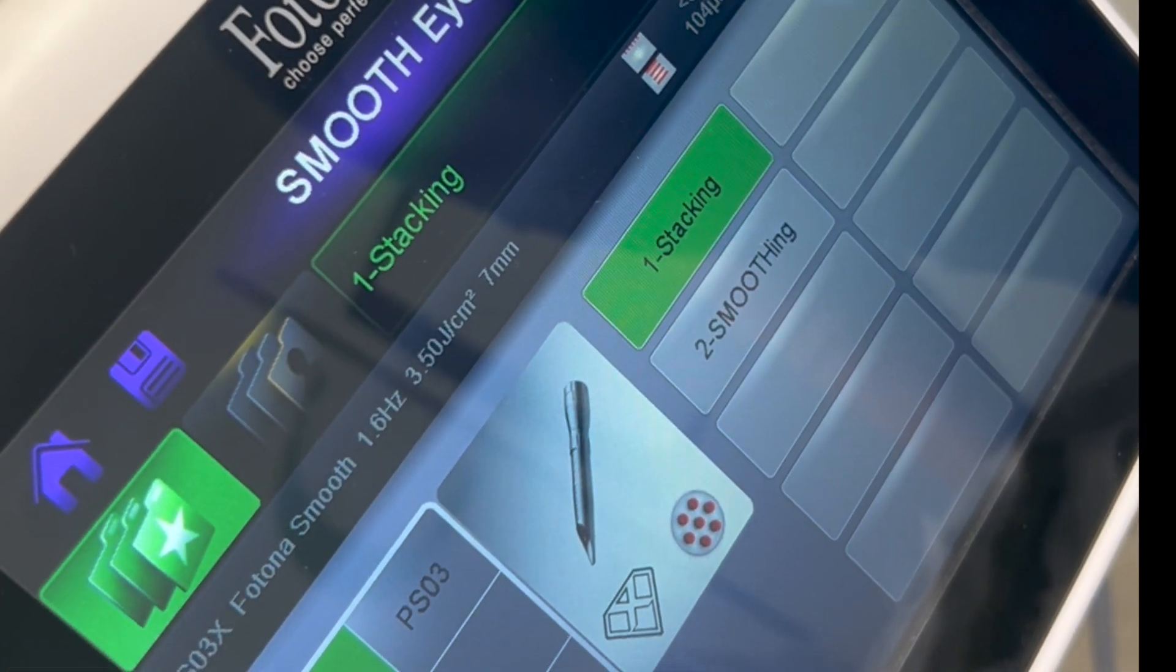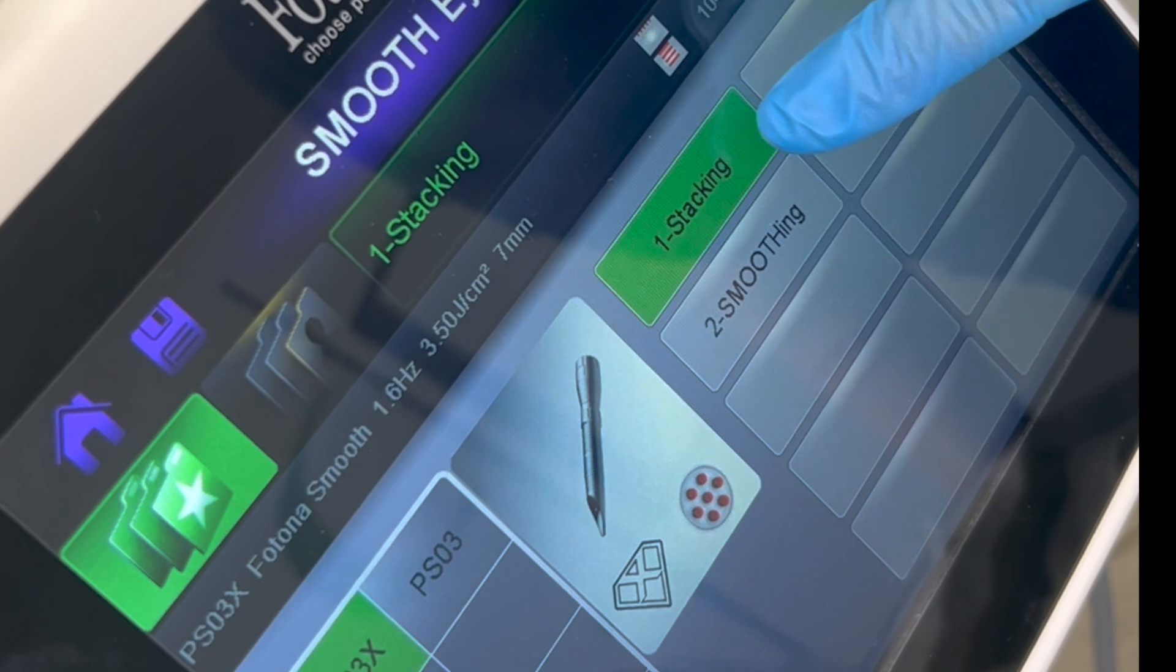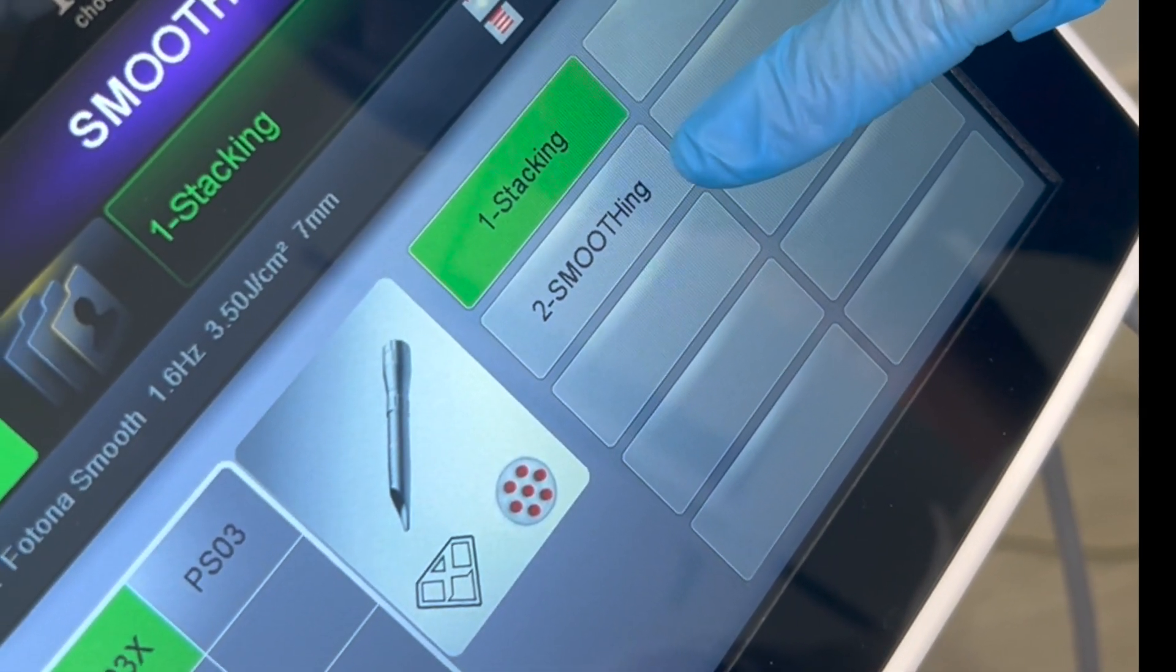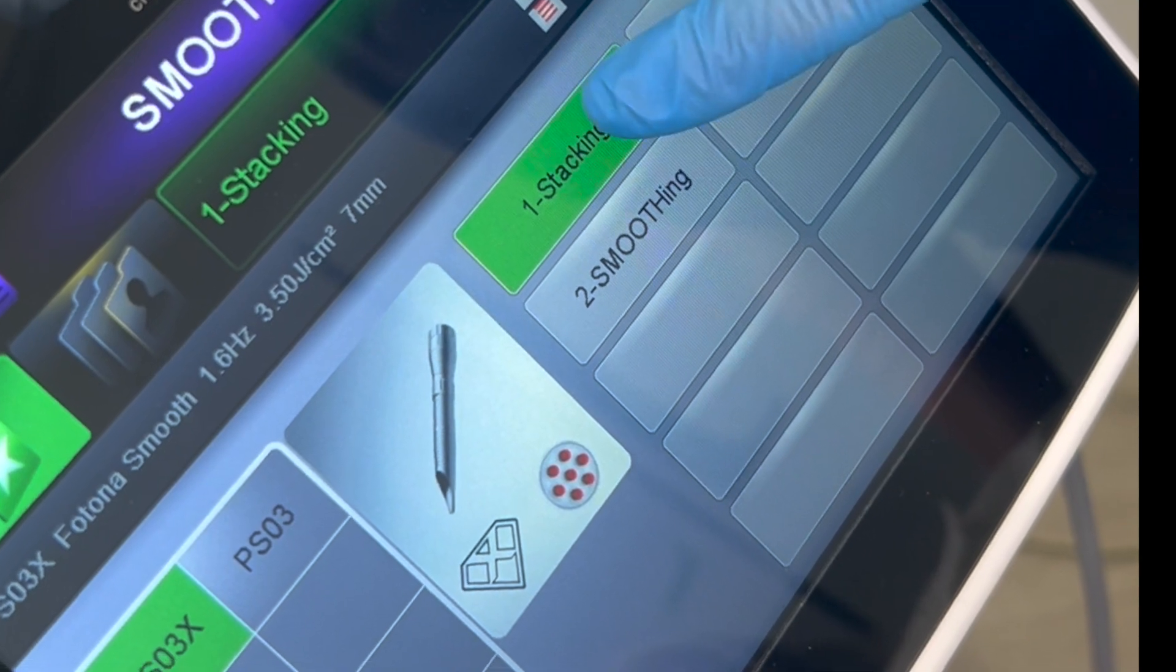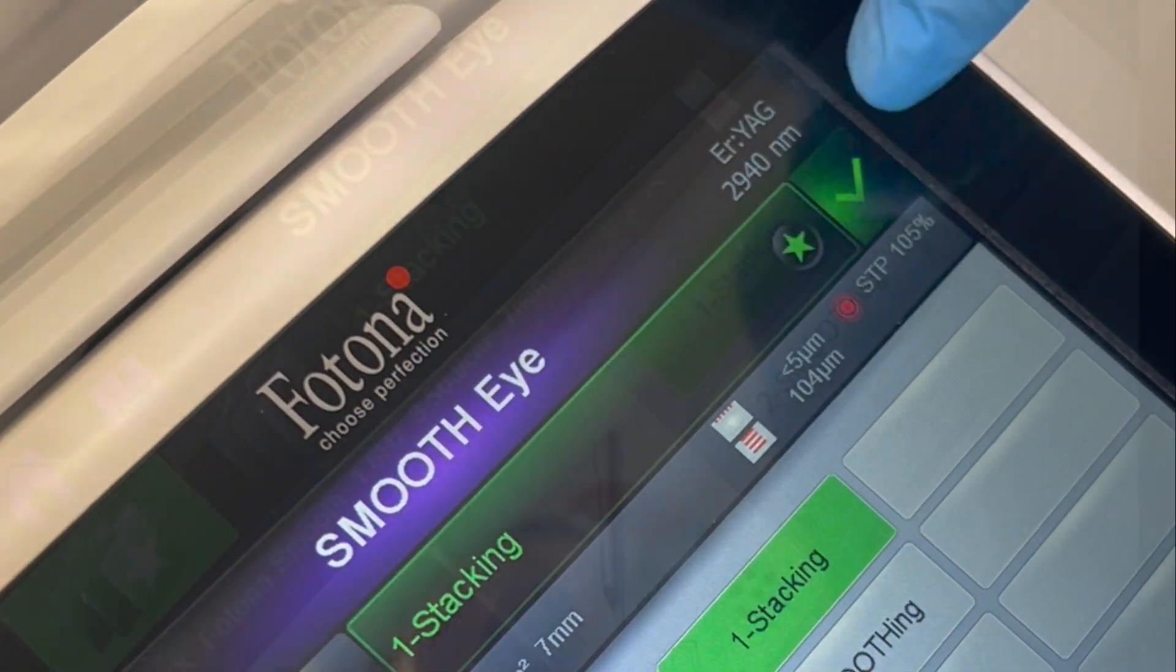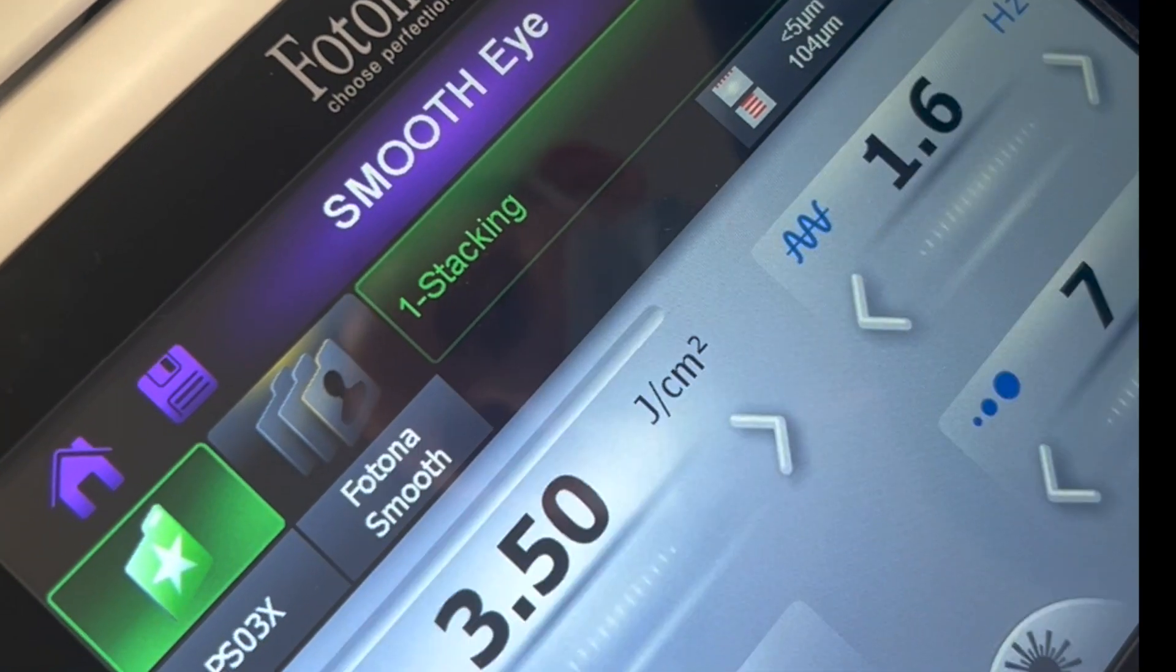This will then open up the next settings page where you can select the correct handpiece and the method that you're using. We will be selecting stacking, and when you're happy with your selection, tick and go on to the following page.